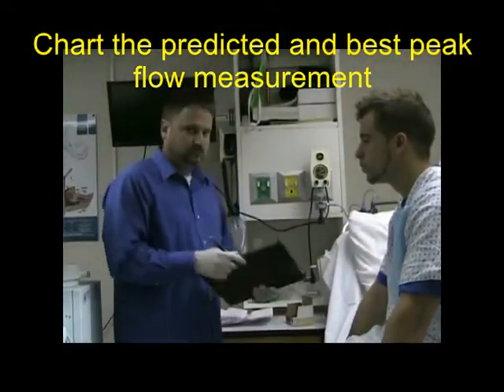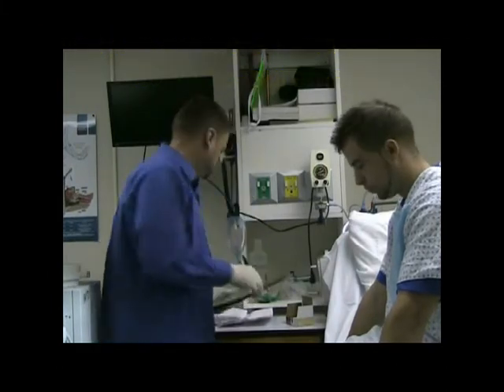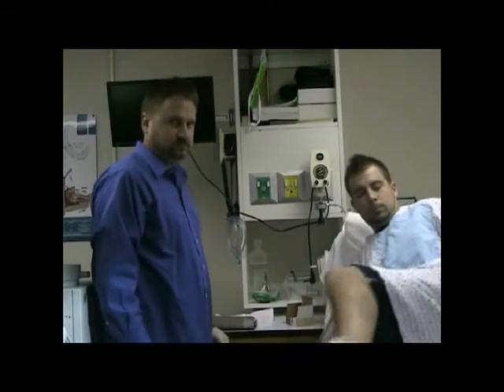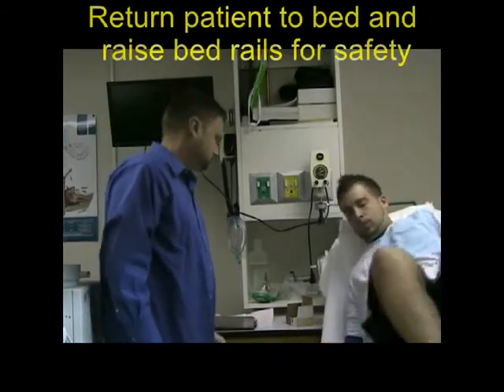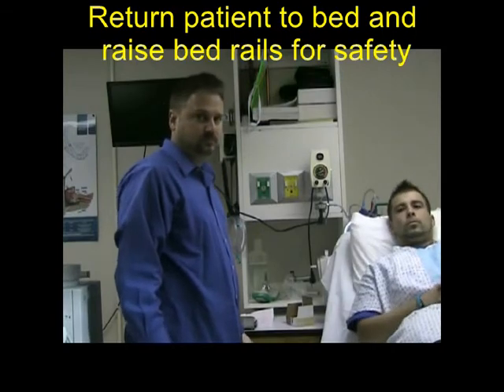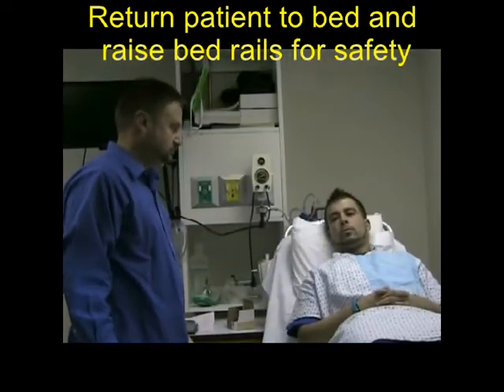Make sure the patient is back in bed and in the correct position, and make sure the bed rails are up.